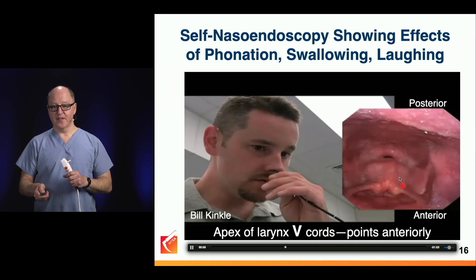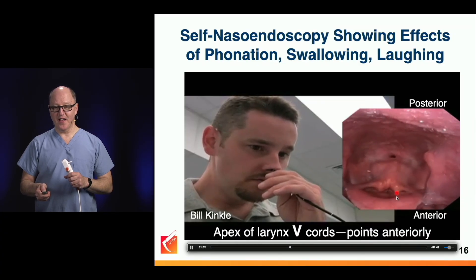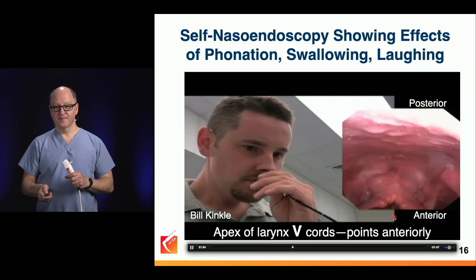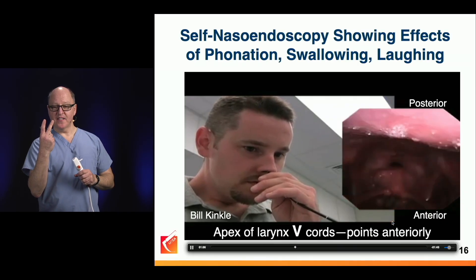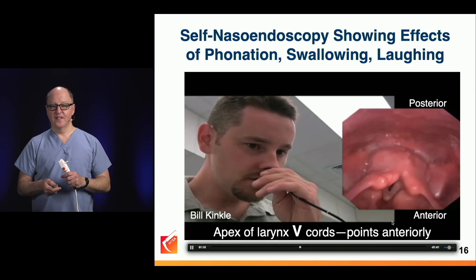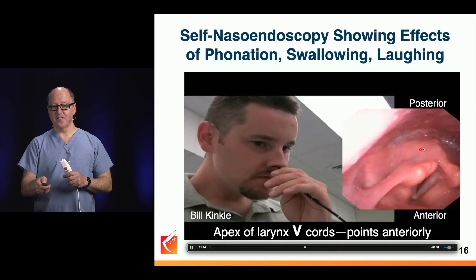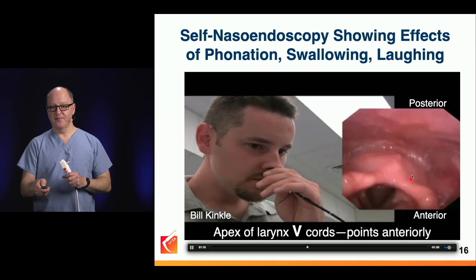There's Bill's esophagus. I am unable to distend my esophagus without vomiting, but Bill can do that. Remember, we are apex down in this view, so anterior is down. And here comes a burp — Bill's going to burp for us. The esophagus is a potential space back here.